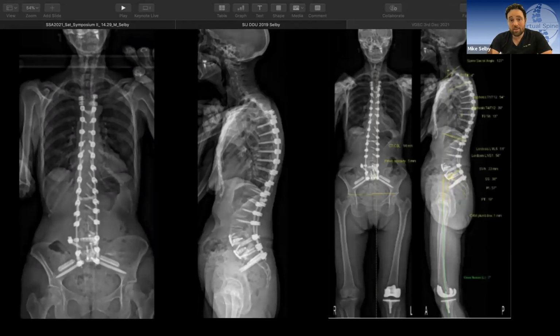Next, doing okay. She's a little kyphotic in that mid-cervical area, so I'm watching that. That's pre-existing. And I think her parameters are fairly nicely restored. She's a happy patient, so that's a good thing at the moment. But she was happy for the first 2 years or so after her previous operation, so I'll keep you updated. Would anyone have any objections to what I've done? Please feel free. Fire away on the chat and let me know. I'll have a look and see.